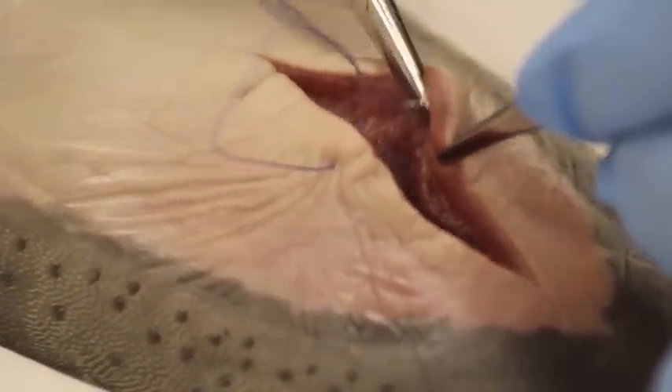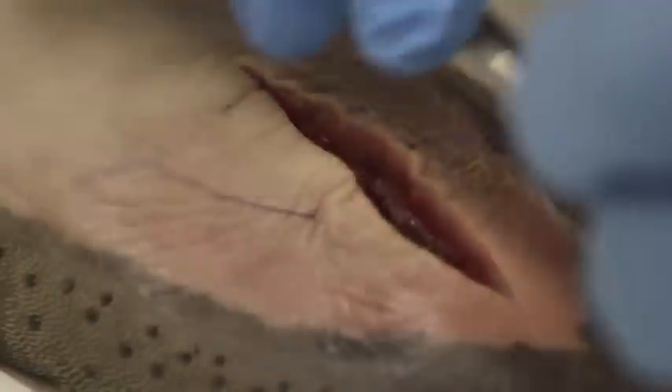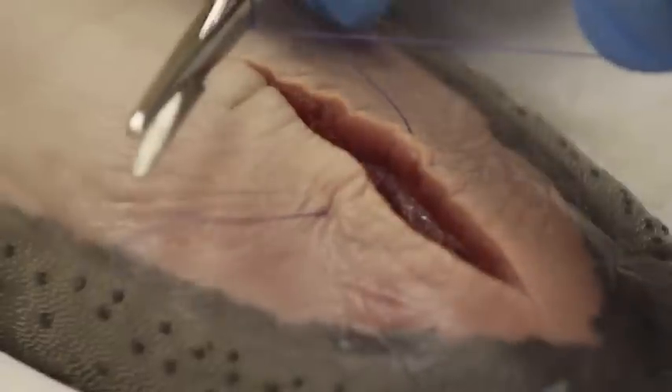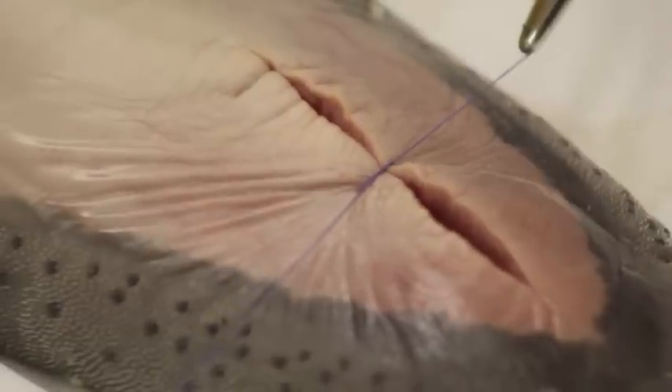Now we start tying — wrap once, wrap twice, grab this, and now we're going to pull. If it becomes loose, pull again and lock the stitch.